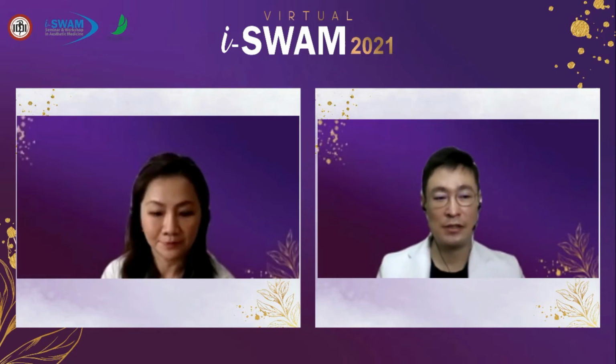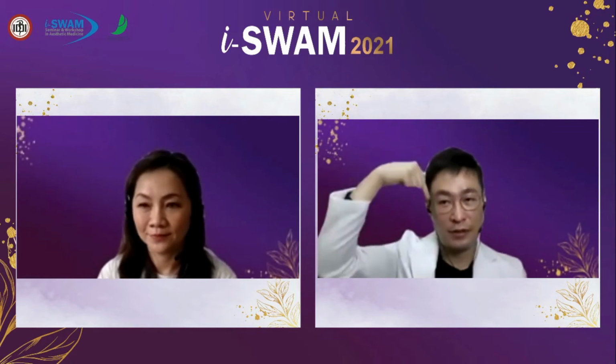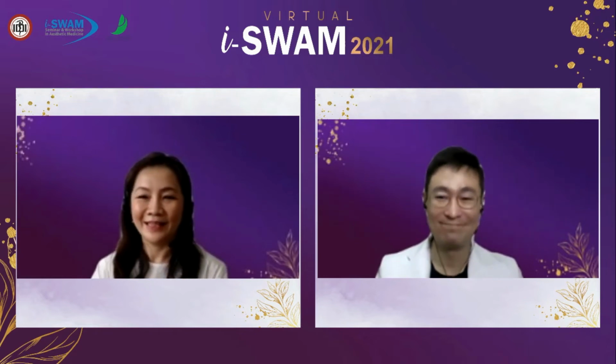Okay. It's quite excellent longevity, because usually when we put threads like this, I can expect only 2 or 3 months.